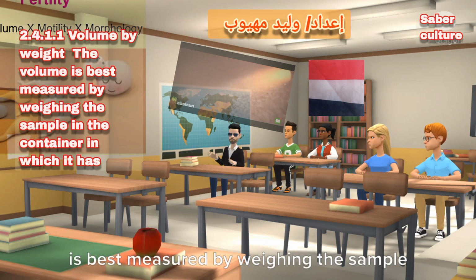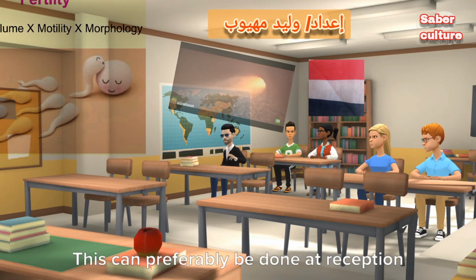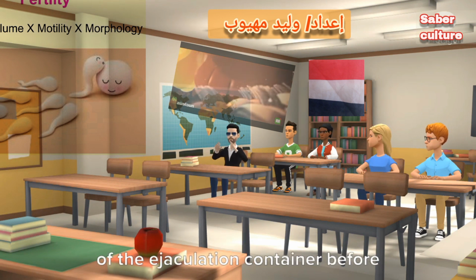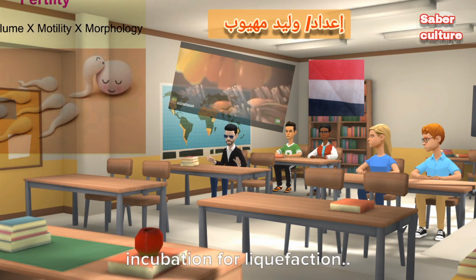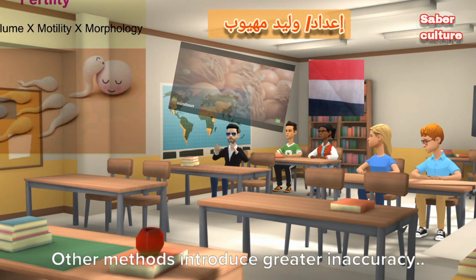2.4.1.1 Volume by weight. The volume is best measured by weighing the sample in the container in which it is being collected. This can preferably be done at reception of the ejaculation container before incubation for liquefaction. Other methods introduce greater inaccuracy.